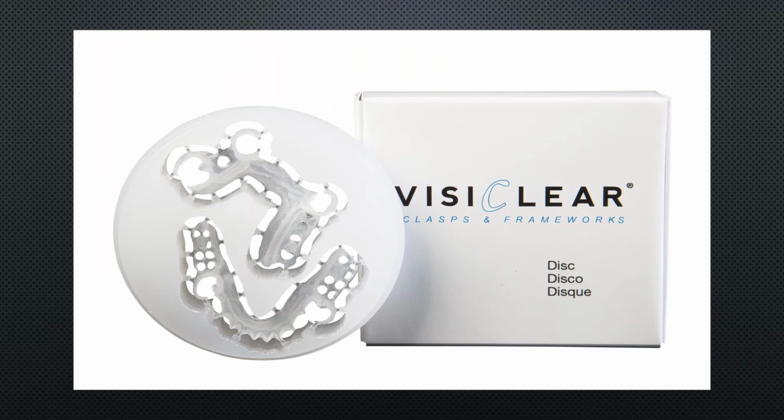There's been a few materials that have come out for frames here recently that are optically crystal clear, and they have those issues. As well as, just keep in mind, anything optically crystal clear is going to be an amorphous, and amorphous plastics absorb moisture. And with moisture come stains, bacteria, and smells. And the last thing you want to absorb moisture is a clear material, because it'll show it.